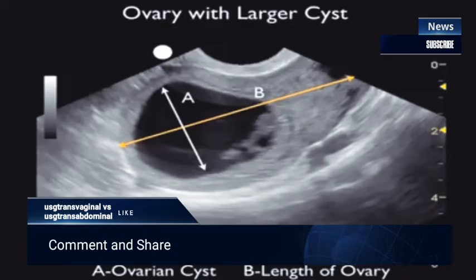But remember that the ovarian cyst is only going to be part of the ovary, and that we should measure both the cyst and the total dimensions of the ovary as well.